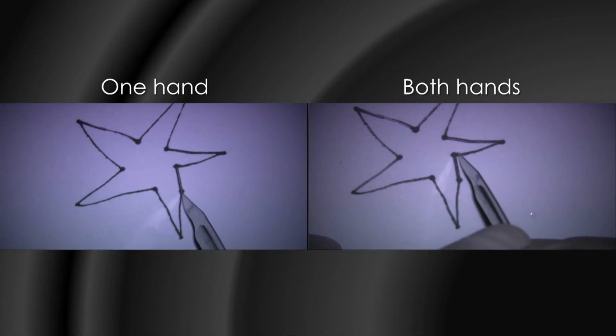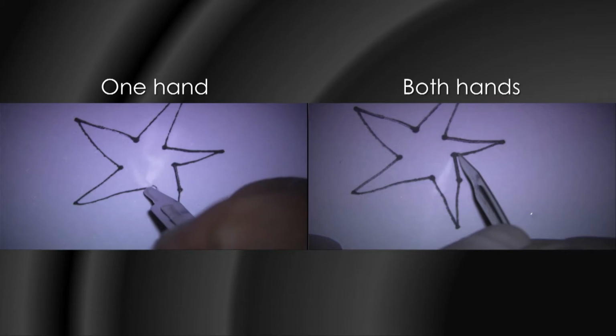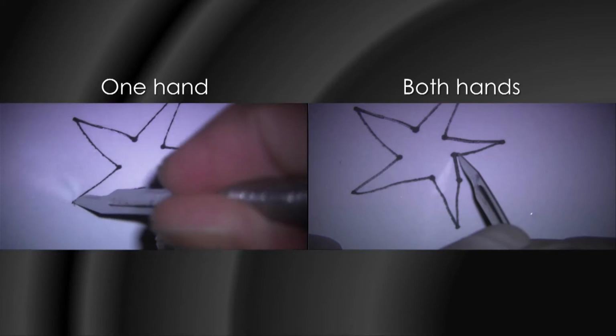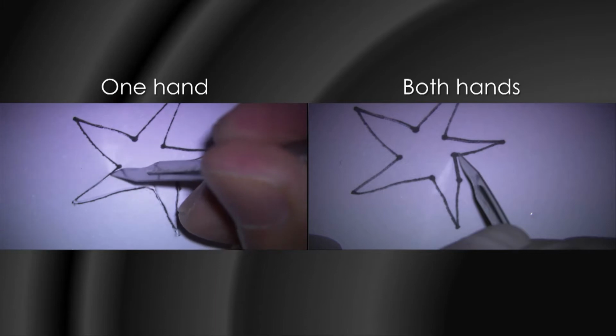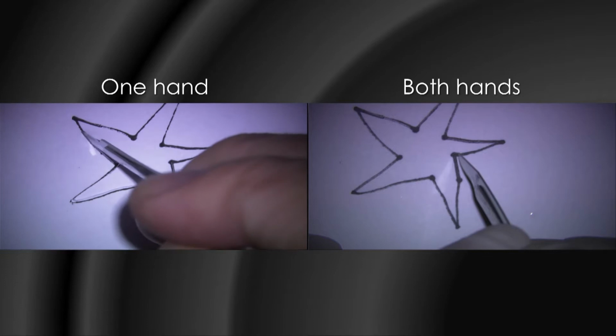Microdental research, comparing a one-handed incision with that of a two-handed incision while using a 15C blade. This is a direct view. This is a one-hand incision. Very difficult. Control the blade. So sometimes slip, sometimes stuck. This is one-hand treatment.